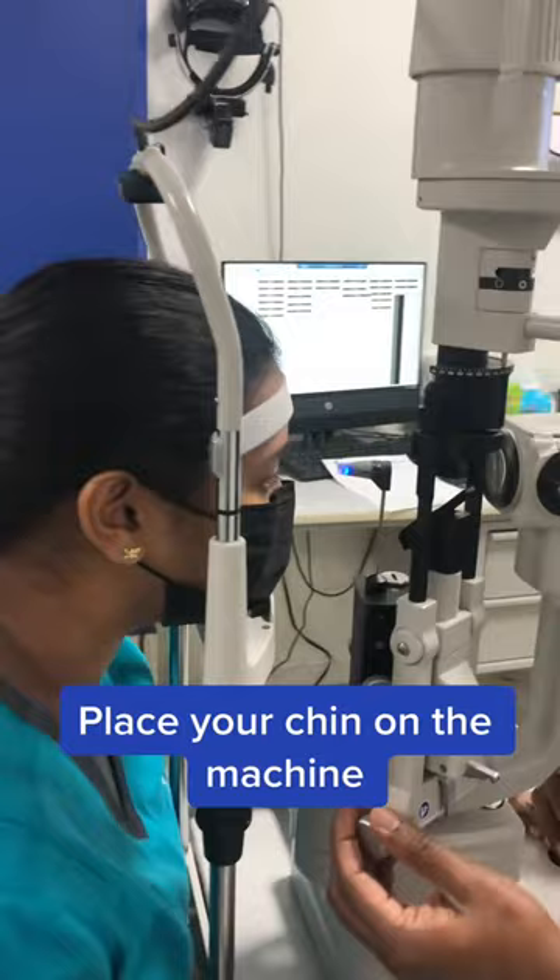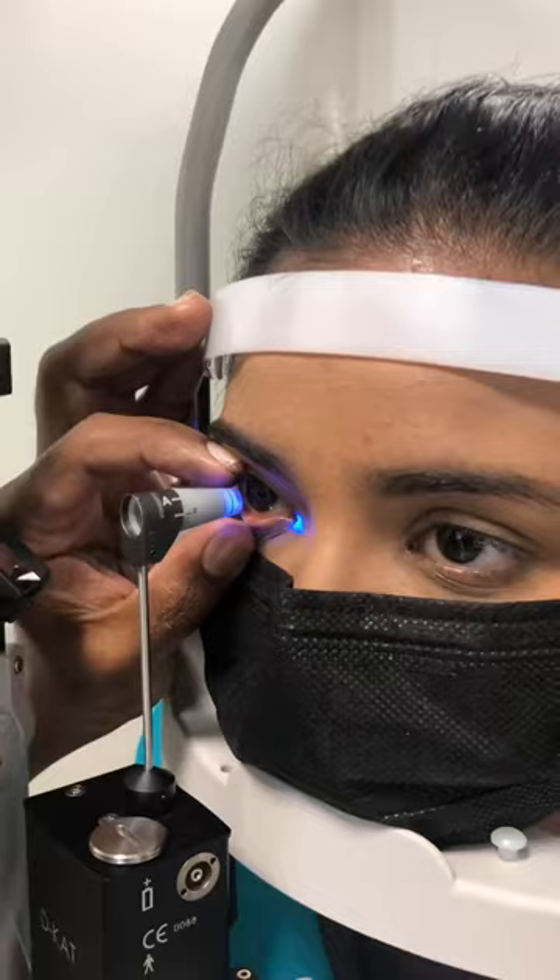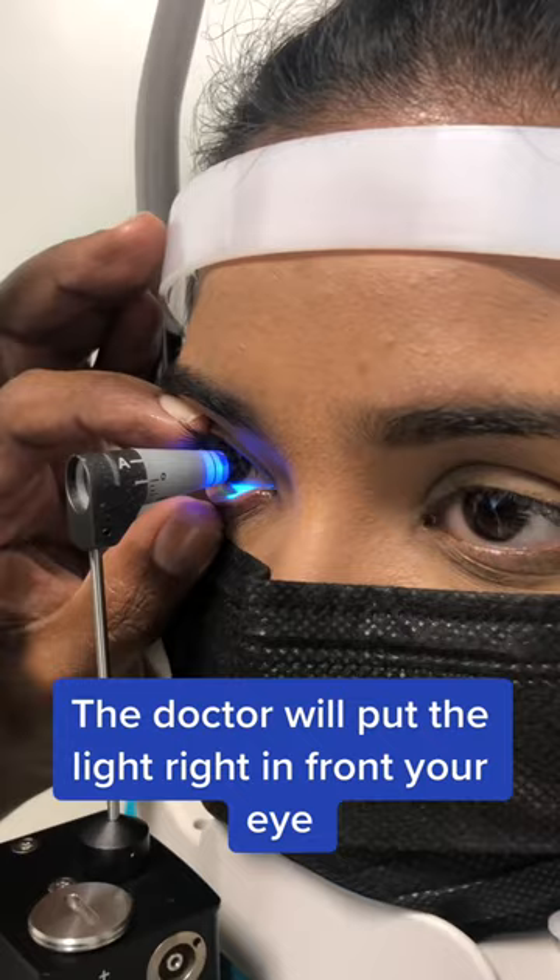Place your chin on the machine. The doctor will put the light right in front of your eye. When the two semicircles meet, we can check the pressure.